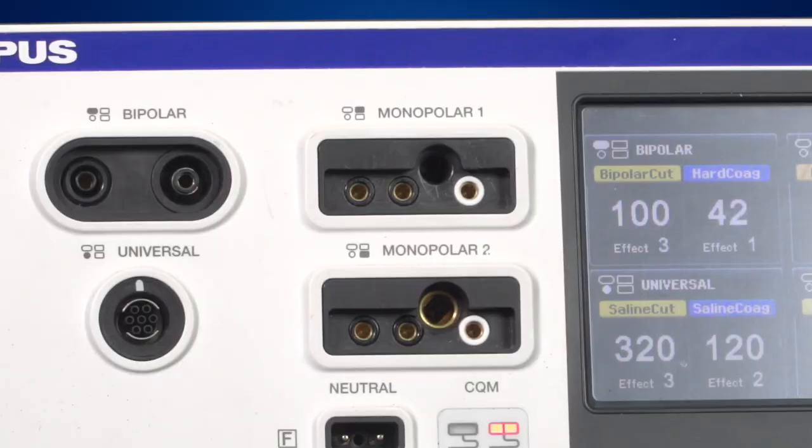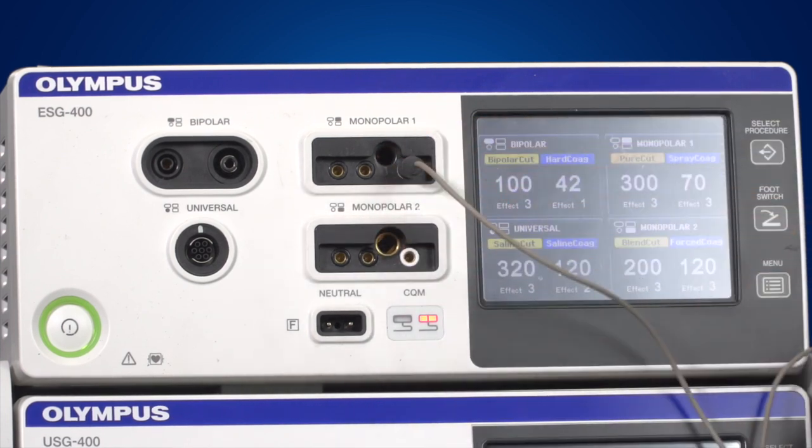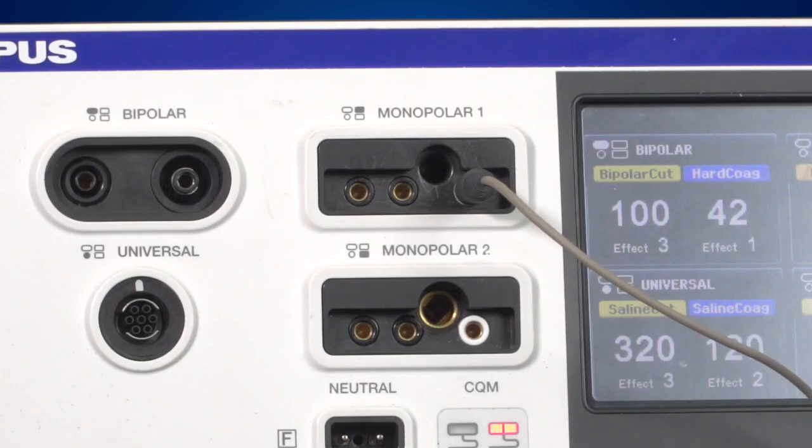It's important to connect the 4mm banana plug into the correct socket. To do this, use the right-hand socket in the monopolar connection area. A white ring around the socket indicates that this is the right socket for the 4mm banana plug. Connecting the 4mm banana plug to any other socket may cause damage to the generator. Always try and remember that white is right.